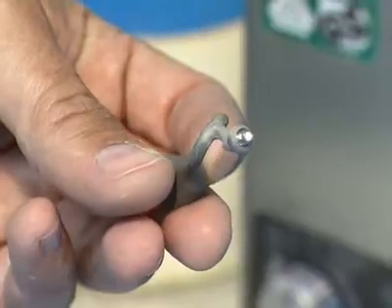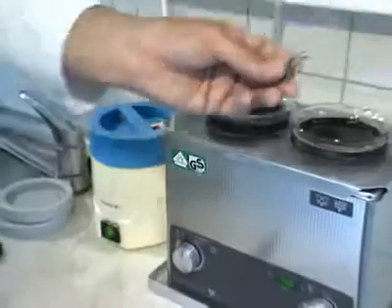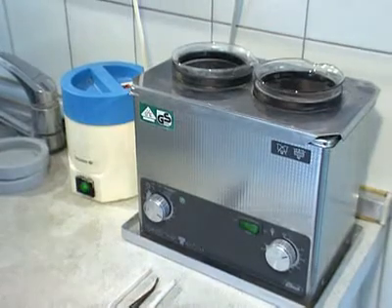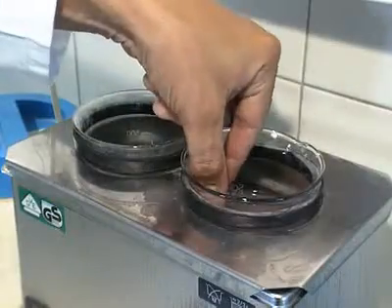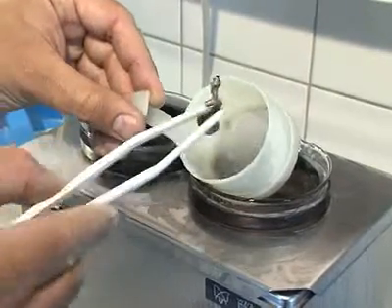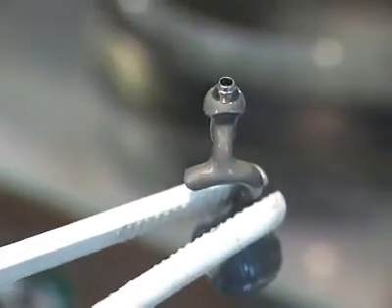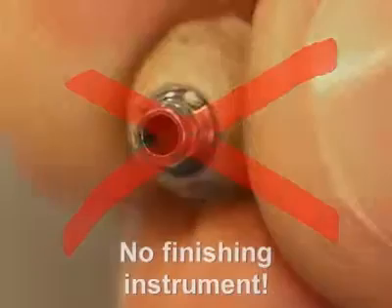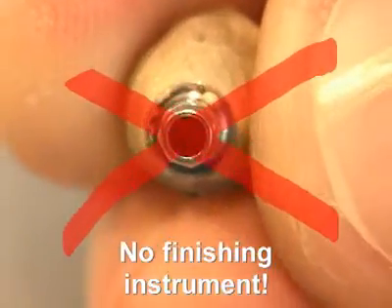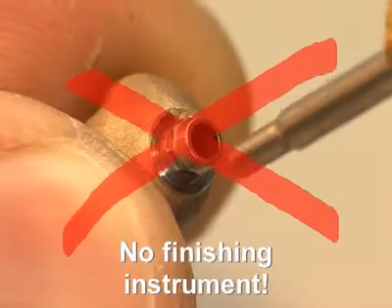After casting the customized abutment, the abutment has to be divested gently with ultrasound, water jet, pickling acid, or glass fiber brush. Never use sandblasting for divestment. This will destroy the fine margin and the implant abutment connection. Intruded casting metals and casting pearls cannot be removed from the shoulder part of the gold abutment with a finishing instrument for the 45-degree shoulder due to design reasons.